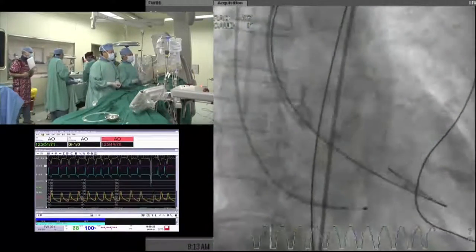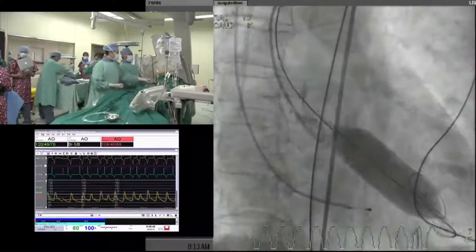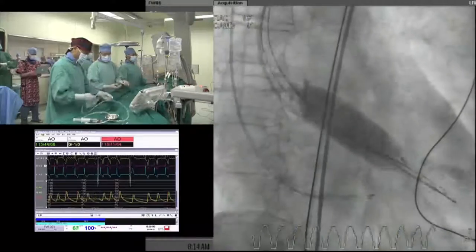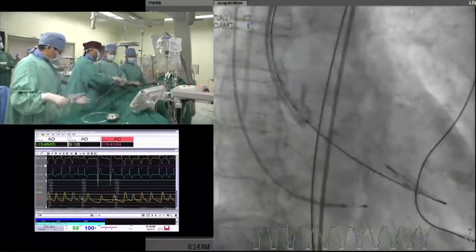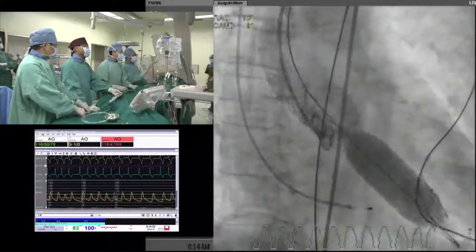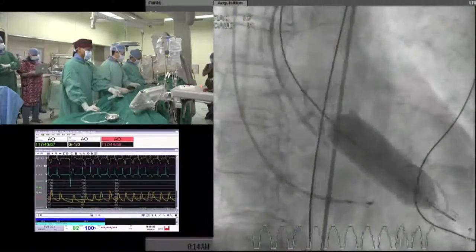Dr. Yang, this is Alan Yang. So is this required by the company to really dilate it to that higher size, or you actually could deploy the valve first? No, not really. According to our previous experience, especially Chinese patients usually have very calcified valves. Before we implant the valve, we should usually pre-dilate completely. It's for a very, very calcified valve. So you have trouble positioning the valve unless it's well dilated? Yeah, to help in positioning. Especially because it is not totally open by the balloon, so there's not enough space for the prosthesis. During the release, the prosthesis always dives to the left ventricle, or jumps out.